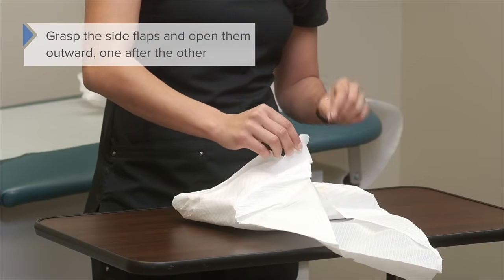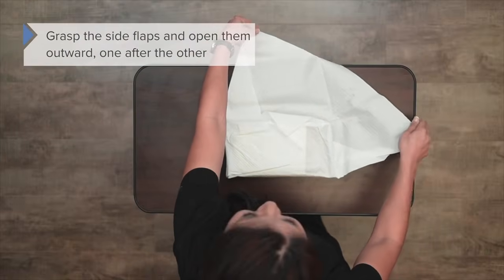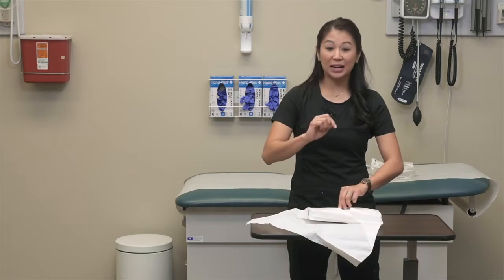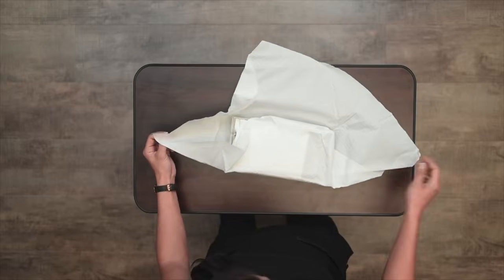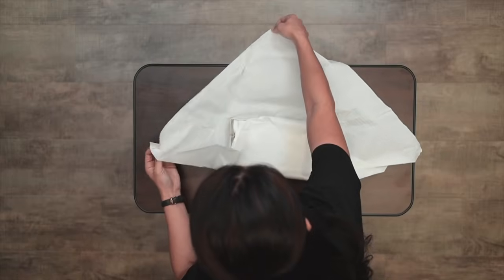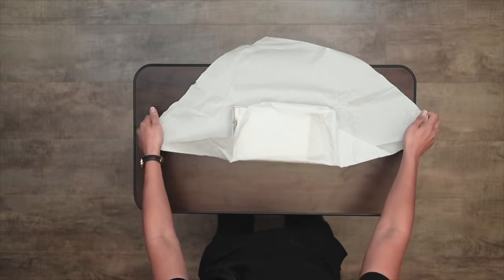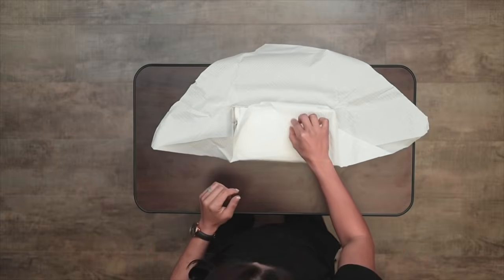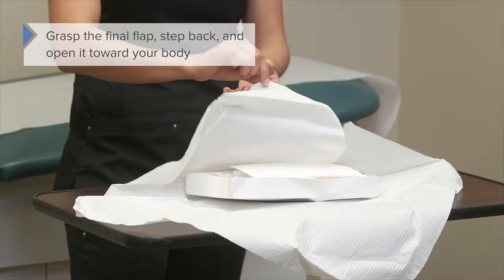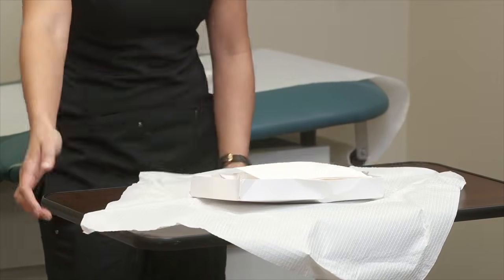So I'm grasping the outside of the package, opening this up, and I'm curling these underneath themselves so they don't flap backwards. I'm taking my next flap and opening this as well. And this can be tricky, as you can see. So notice I'm touching these edges and really trying to make sure these curl down. Then I'm going to take my final flap and I'm going to open this toward my body. Now watch when I do that. I'm going to move away because I do not want to interrupt my sterile field.